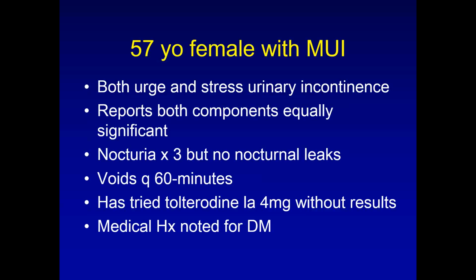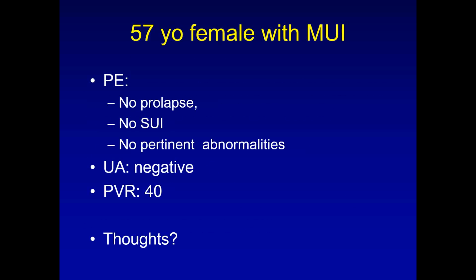She's diabetic. With diabetes, you can get a diabetic impact on the bladder. You get the classic diabetic cystopathy, but she probably doesn't have that because her residual is so low at 40 cc's. But she could be a strain voider. With diabetic cystopathy, she'll have a weak bladder or no contraction, and she may be able to empty only because she's straining a lot.